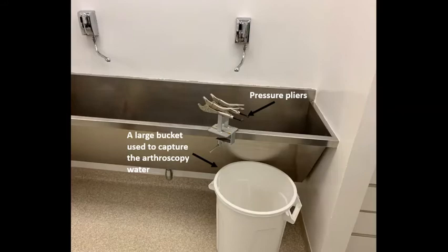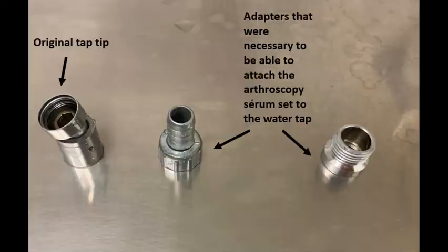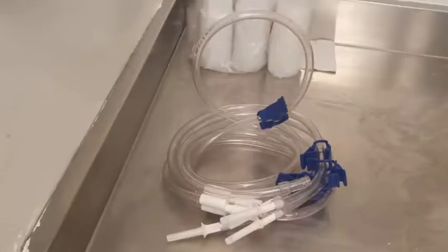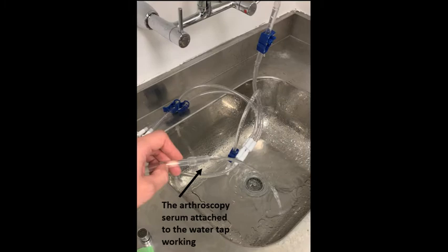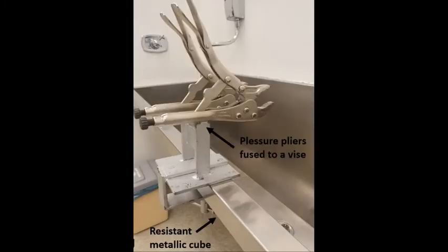We use a fixed anatomical piece holder — a pressure plier vise — attached to a rigid surface. A large box must be purchased to function as a container for the water used to perform the arthroscopy. A water tap must be adapted to connect one way of the four-way equipment and supply water continuously. Adapters may be necessary for this purpose. We again highlight the pressure pliers through these two fixation points.